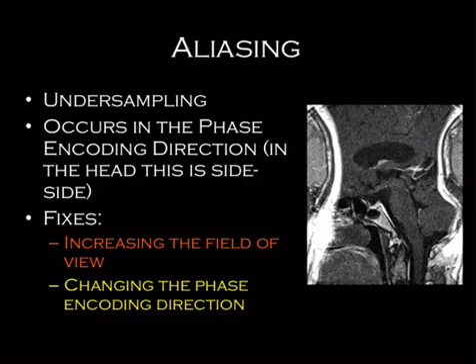The next thing you need to know is if it's phase encoding, frequency encoding, or neither or both. And I will tell you that it's almost always phase encoding, so if you can't remember, just pick phase encoding. You'll be right like 95% of the time. The last thing to know is how to fix it. So that is a list of things to know.